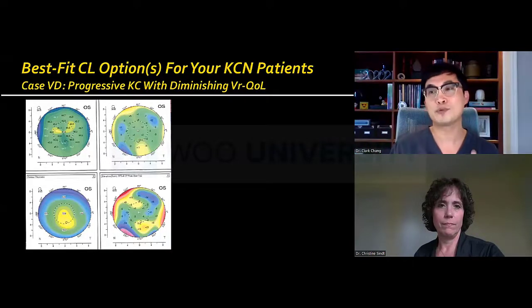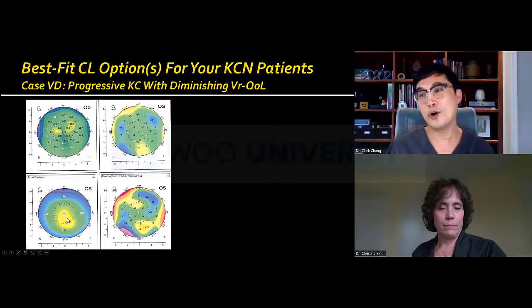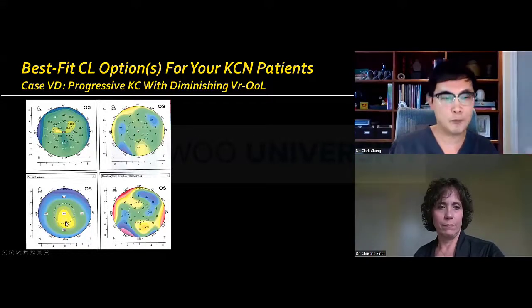Cornea looks clear, but we already talked about the fact that anatomical signs are not going to come early. There's no inferior steepening looking at the axial map, of course. And then the pachymetry isn't all that thin if we're only going by one point of pachymetry.